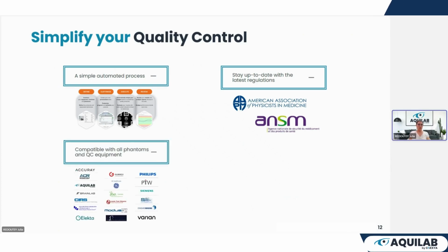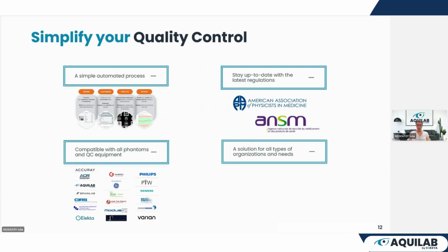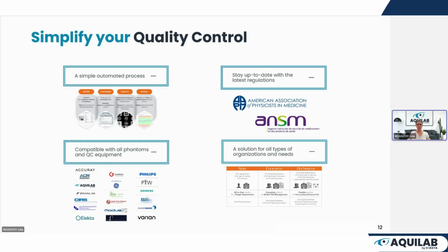It is compatible with all phantoms and QC equipment, and it's a solution for all types of organization and needs. We have 3 formulas that can meet your needs: the Solo one, the Concerto one, and the Orchestra one.